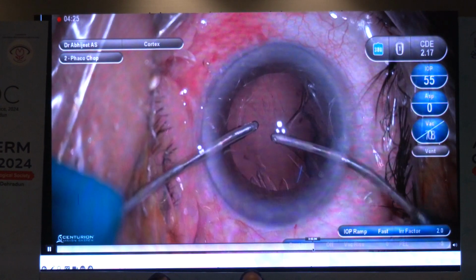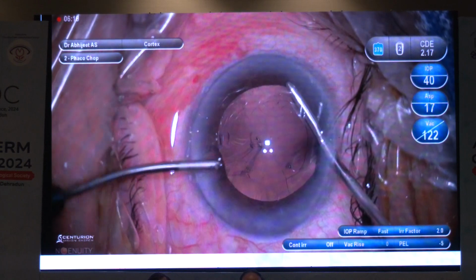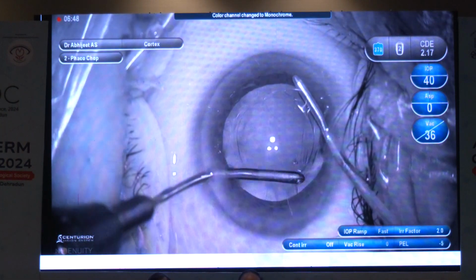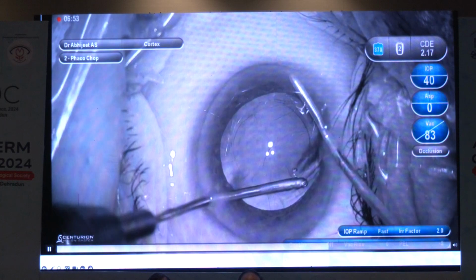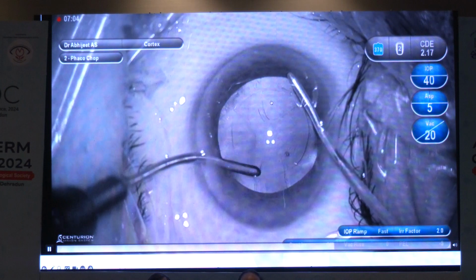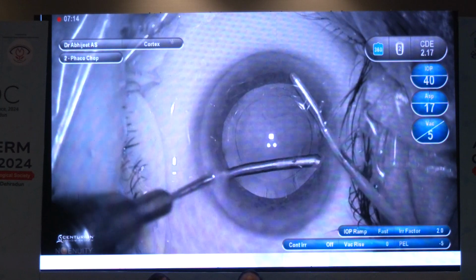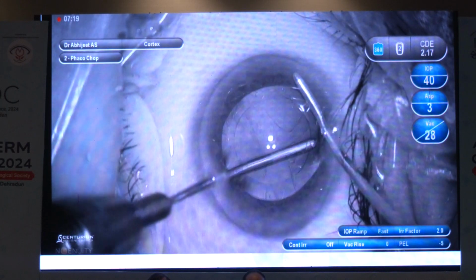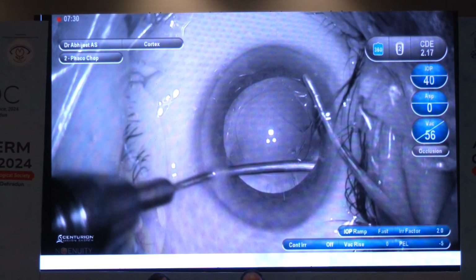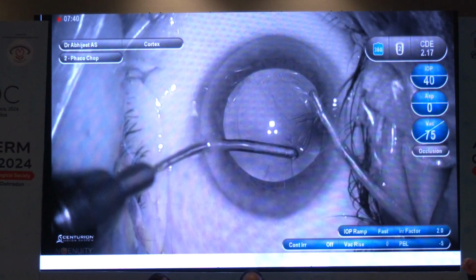I'm going to skip a few things and show you the difference between the sudden contrast change that we get. Now here, when I change into this particular filter, you can see up here, there is a very small peripheral rent out there. And you can actually see the fibers of the vitreous in the same, because of the high dynamic resolution. So the contrast values help you discern between even the viscoelastic that you would use and the vitreous.